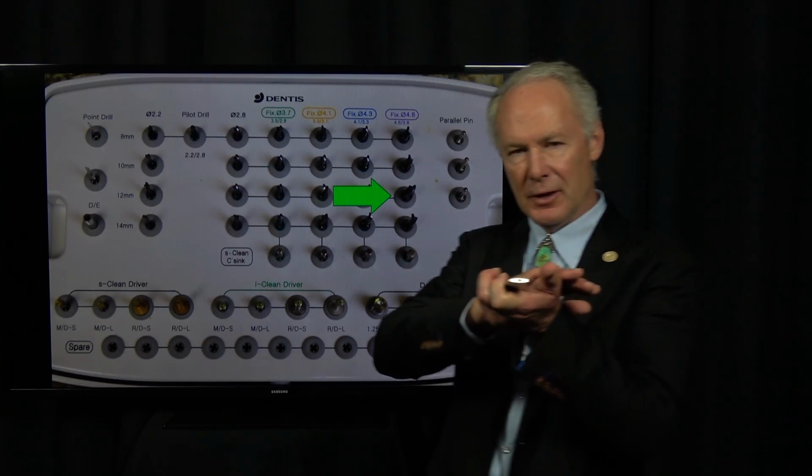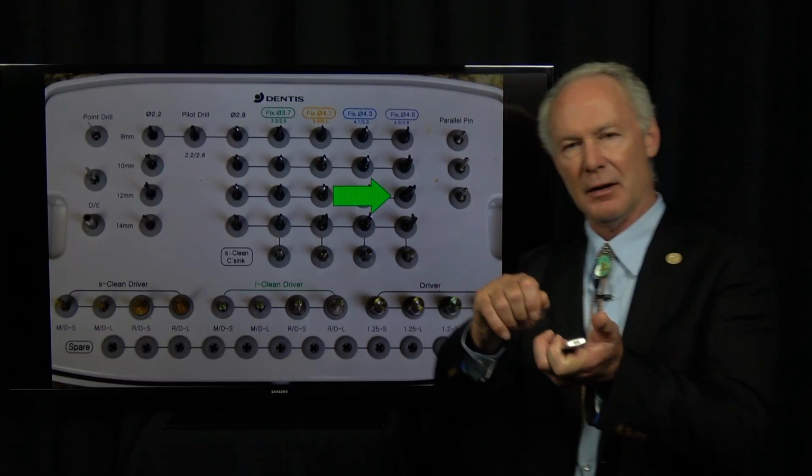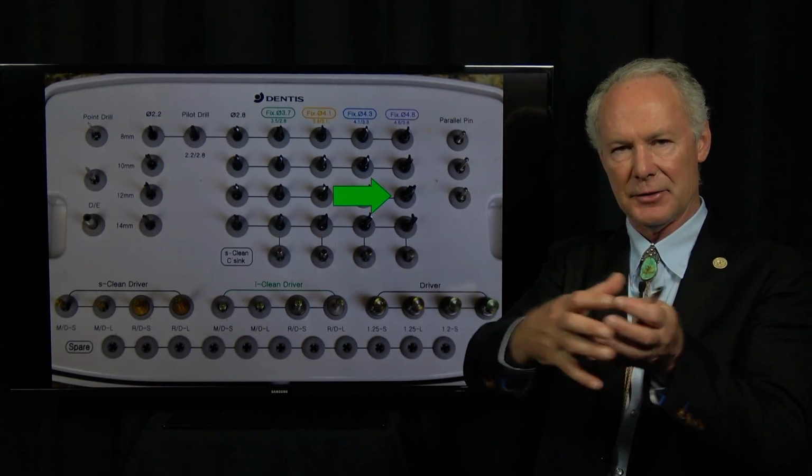Now the 35 Newton centimeter situation is kind of interesting because as long as it's screwed in well, as long as it's tight, we're not loading it for 3 months. And so as long as it's tight, even if you don't quite get 35 Newton centimeters of torque, but you're placing it into a flat alveolar crest with lots of alveolar process, it doesn't have to be 35 Newton centimeters if you're not loading it right there.